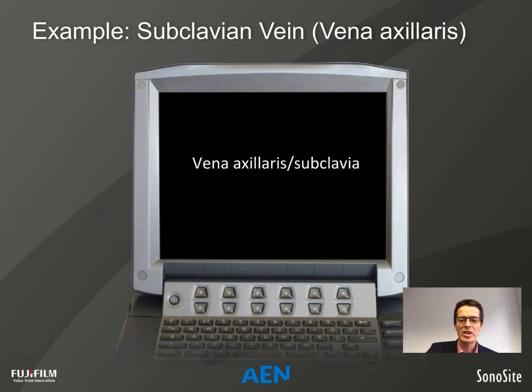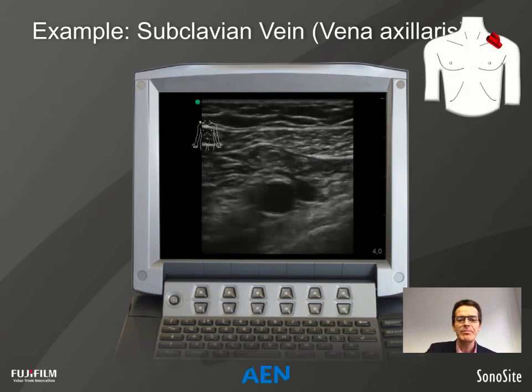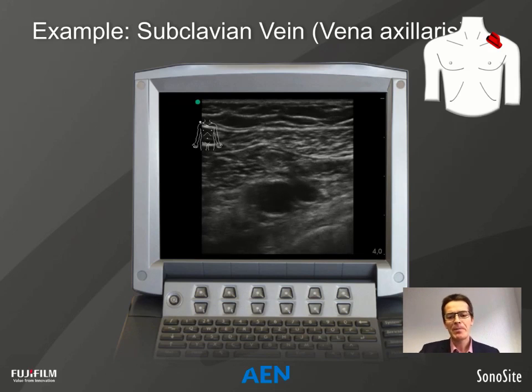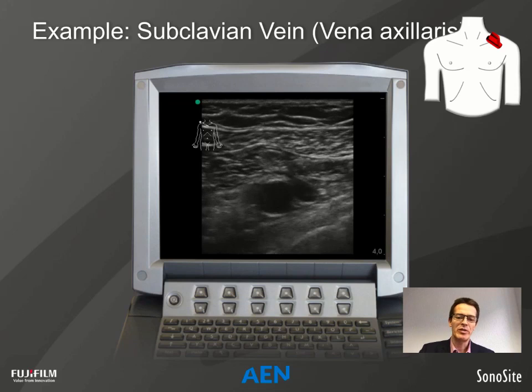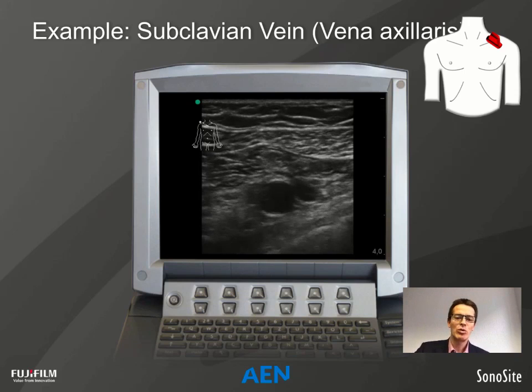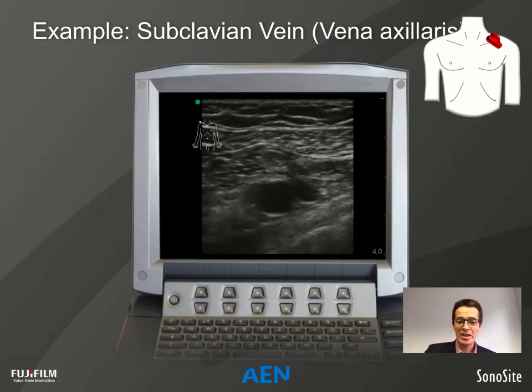As an example, we present a vascular access of the axillary vein and subclavian vein. The normal sonoanatomy shows on the medial side the vein with a typical double pulsation. Lateral from this is the subclavian artery, and further lateral are more echogenic structures representing the brachial plexus. On the other side you see the pleura with some lung sliding. Under the plexus structures there is a little bone shadow — this is the rib.